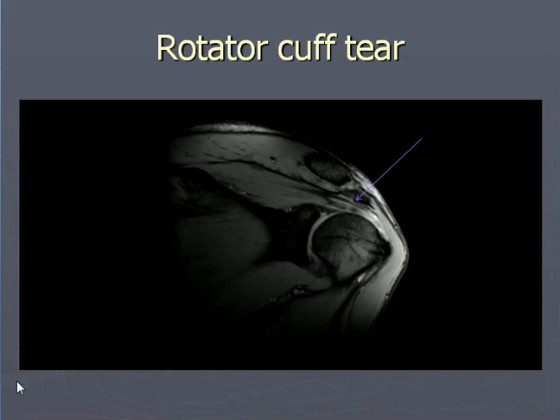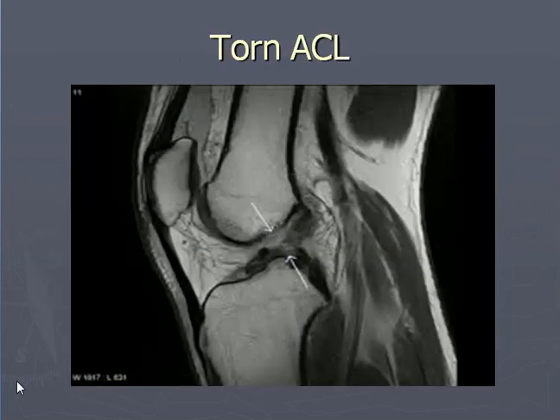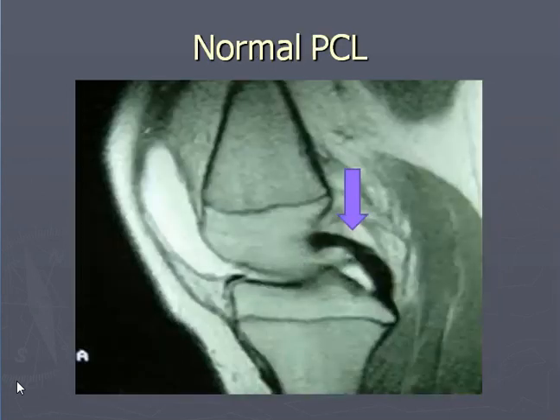Rotator cuff tear. Ultrasound can pick up rotator cuff tears very well, but MR has the superior edge where you can see the other structures in one image. The arrow depicts a partial thickness tear of the supraspinous tendon. This is also a case of Bankart and Hill-Sachs lesion along with effusion in the shoulder joint. This shows near complete rupture of the anterior cruciate ligament — there is loss of normal signal through the anterior cruciate ligament. The posterior cruciate ligament is normal, showing dark signal or low intensity which is a normal finding.